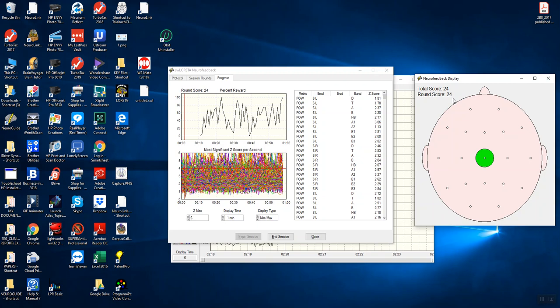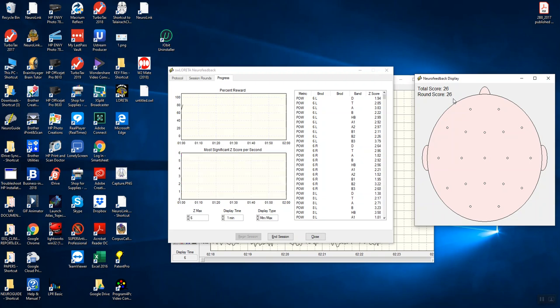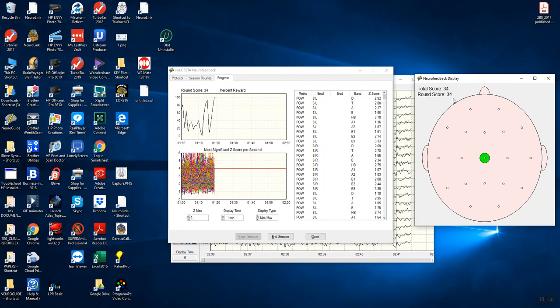It facilitates linking patient symptoms to the patient's brains and to be able to evaluate the relative efficacy of treatment. So you can look at treatment over time, over sessions. So it gives the clinician feedback, quantitative information, important information about symptom severity, in parallel with improvement in the efficiency and stability of network hubs, brain hubs and brain connections, as one then helps patients towards greater and improved mental health. So that was a brief introduction to NeuroLink.